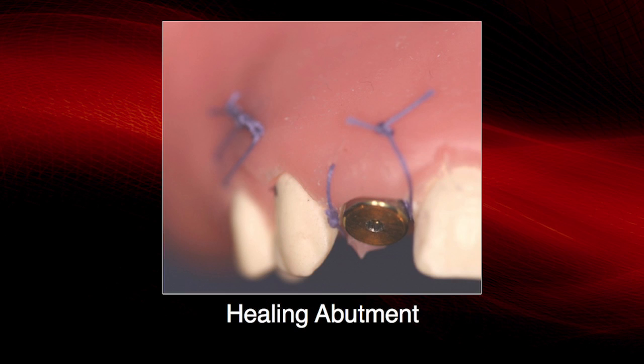Now after healing, implant prosthetics is just unscrewing the healing abutment, placing an impression coping, taking an impression, taking a bite, and sending it to the laboratory.